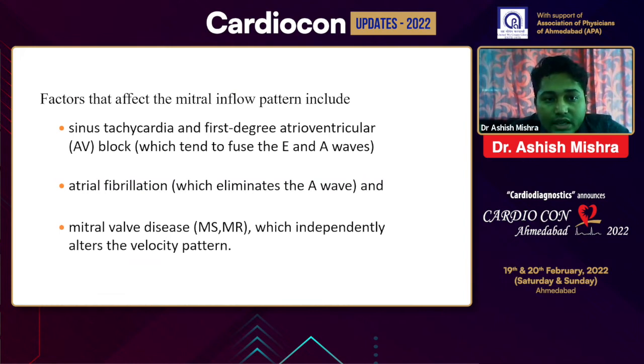The factors that affect the mitral inflow pattern should also be taken into consideration. These are particularly extremes of heart rate, such as sinus tachycardia, first degree atrioventricular block, atrial fibrillation, and mitral valve disease in the form of mitral stenosis and mitral regurgitation.